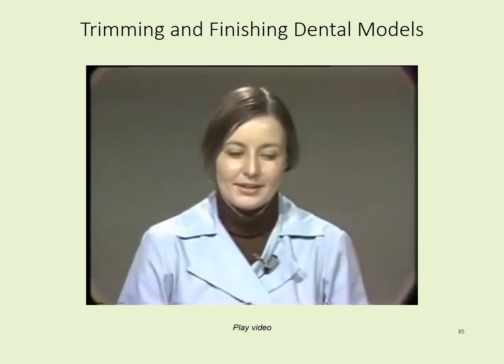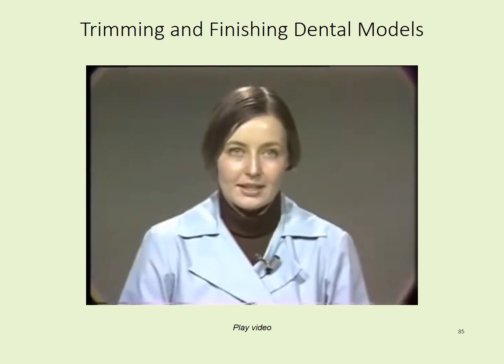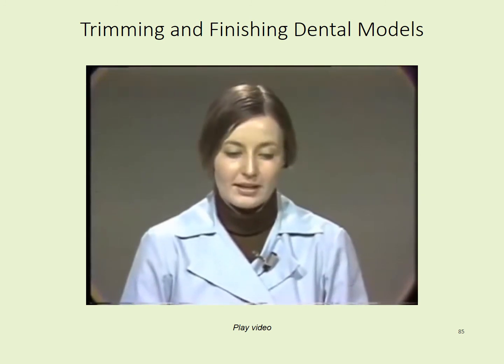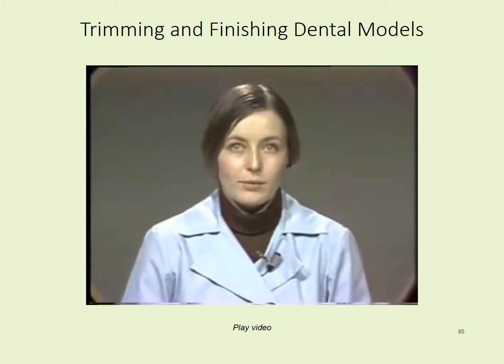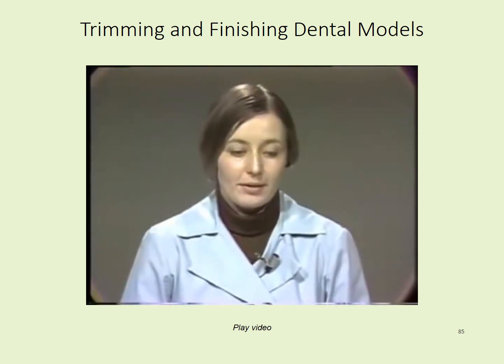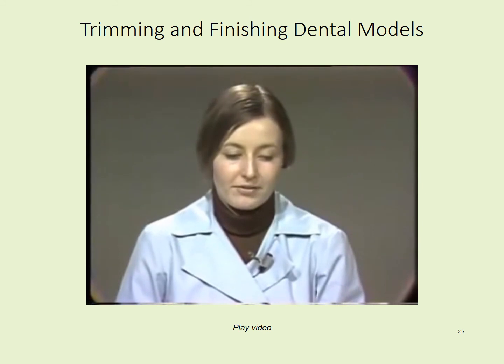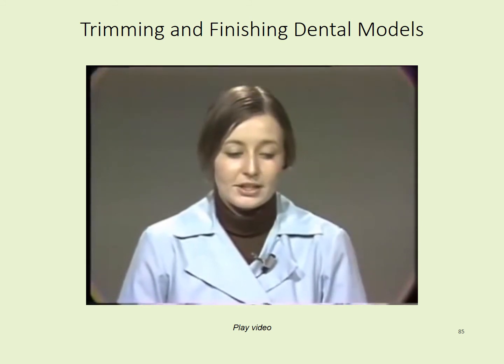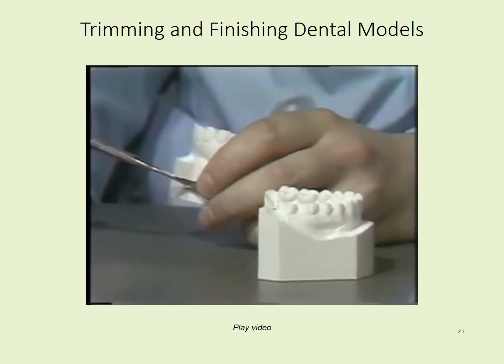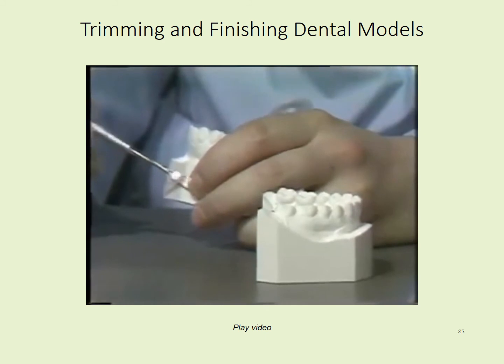Now that our models are all trimmed, I'd like to say a few words about finishing the models. While they're still wet, fill in any voids with a mixture of plaster about the thickness of heavy cream. When the plaster is fully set, smooth all the flat surfaces using a large Arkansas stone or sandpaper.